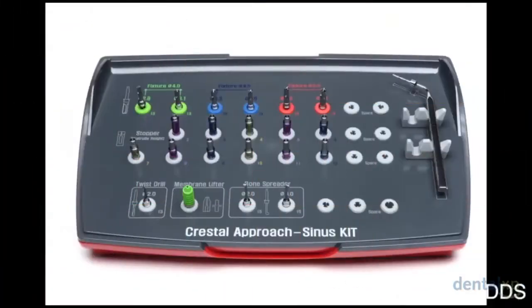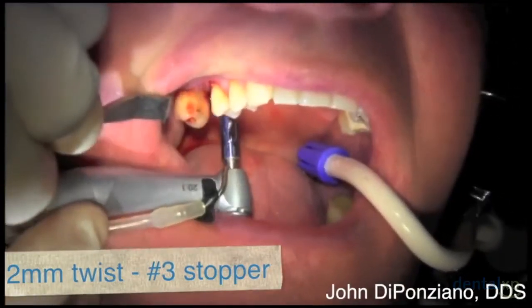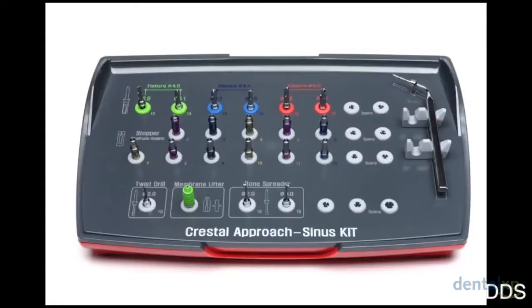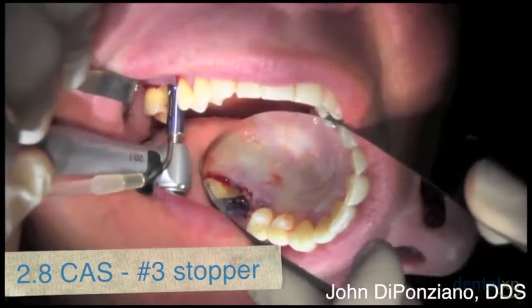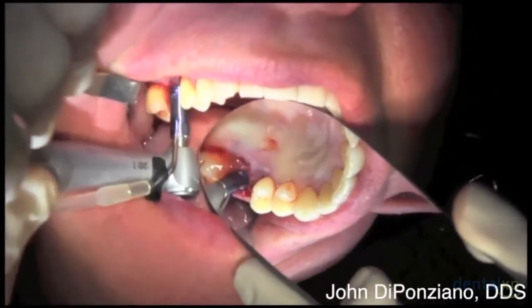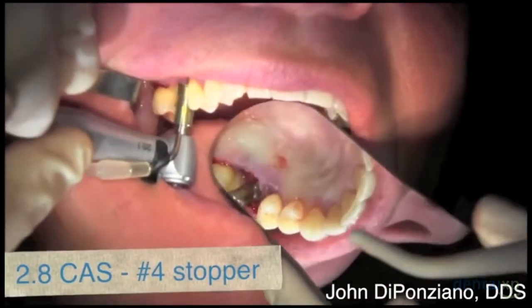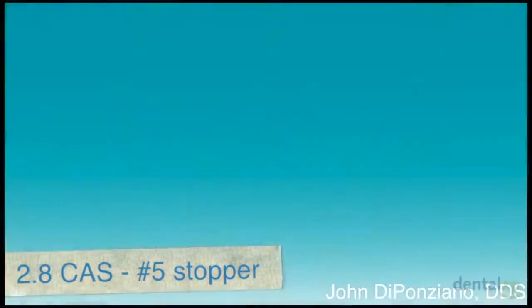Now we're going to start with the CAS kit — the Crestal Approach Sinus Kit by Osstem. We'll use a number two twist drill with a number three stopper, which allows only three millimeters of the drill to protrude — a depth-limiting stopper. We then go to the actual CAS drill, which is 2.8mm, with a special round tip rather than a cutting tip. We slowly progress one millimeter at a time: number four stopper with the 2.8, then the number five stopper with the 2.8.